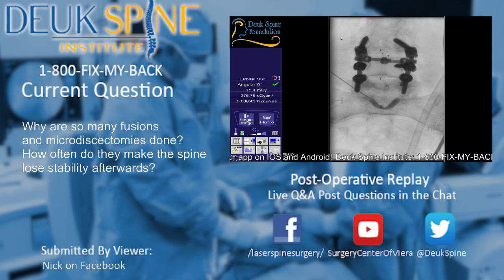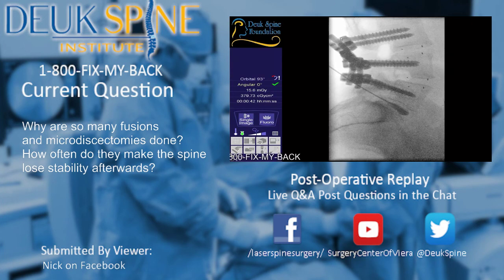That was our last question, and it's been a great day hanging out with you guys and gals for two cases. We saw a posterior cervical laminectomy and fusion earlier today. You got to see the spinal cord. You got to see screws and rods going in the back of the neck into the spine. And then you just saw a Deuk Laser Disc Repair endoscopic procedure to repair a damaged disc that's adjacent to a fusion. And this patient did not want to go through another fusion, so they had a tiny little incision, and we repaired the disc endoscopically.